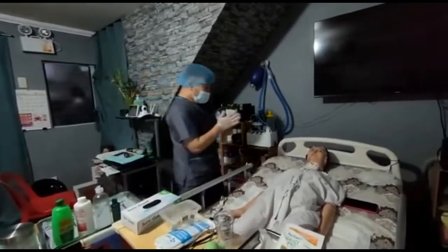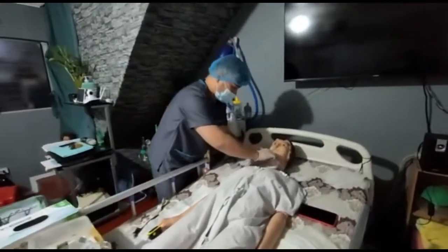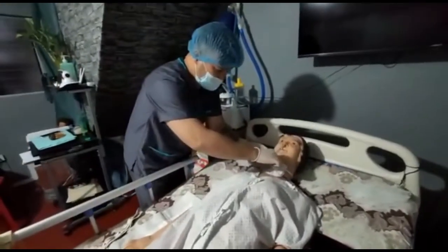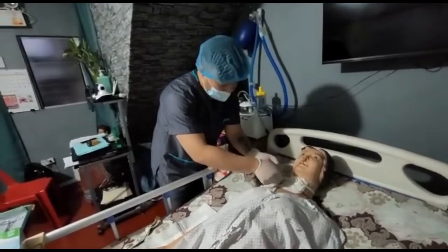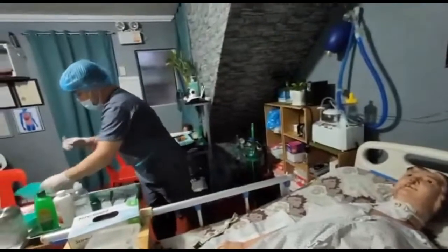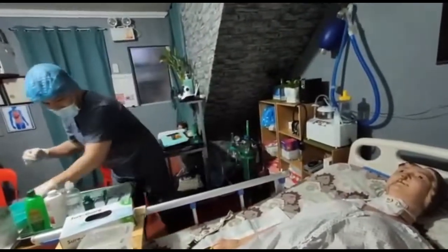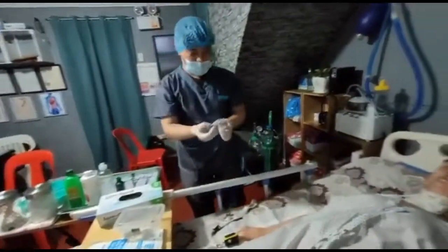Okay na. Ayan ma'am, so tatanggalin ko na po yung trach nyo, ha. So hilahin po natin siya pababa. And then, side towards us. So lalagay po natin siya sa kidney basin. And then, i-replace po agad natin yung temporary.